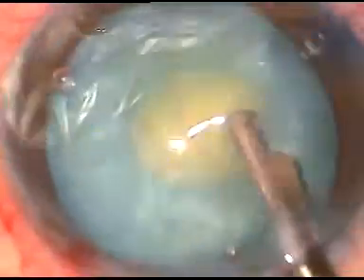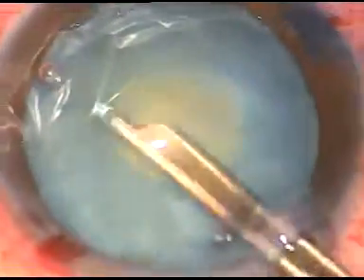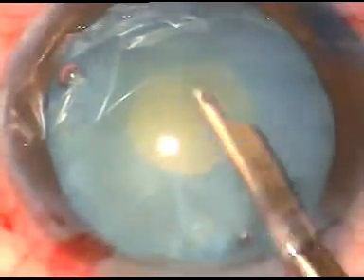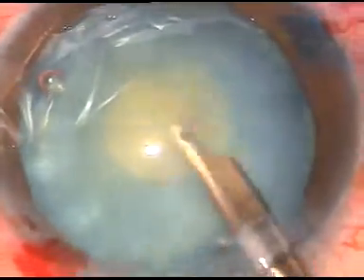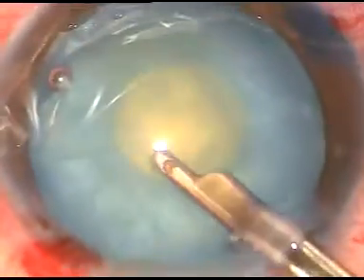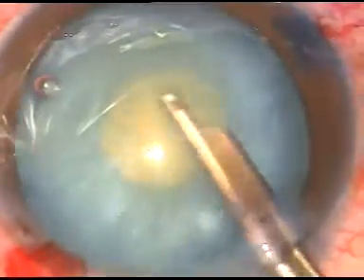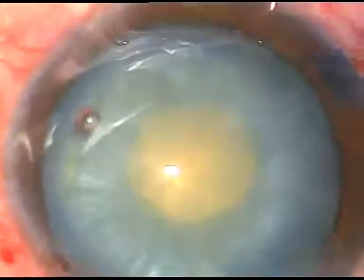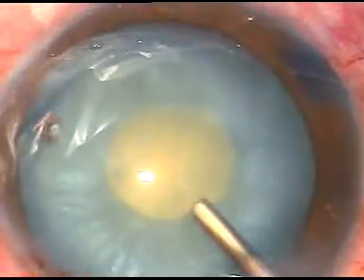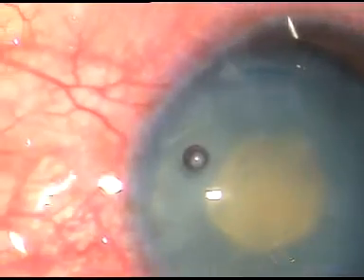Now milky fluid came out because there was high intralenticular pressure. This pressure is decreased by aspirating some superficial lens matter with the help of a direct Simcoe cannula or bimanual IA. As soon as we remove some superficial cortical matter and decrease the intralenticular pressure, the character of the cataract totally changes, and when we enlarge this small rhexis, it does not tend to run into the periphery.